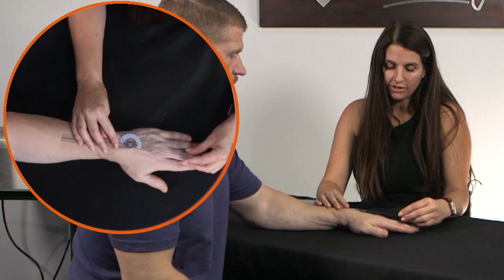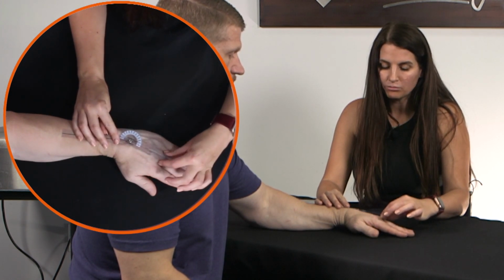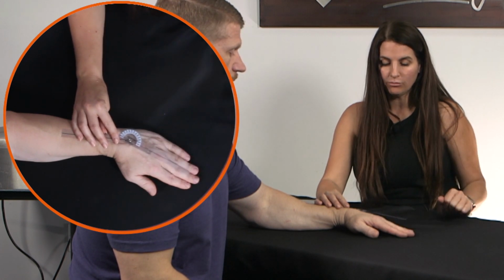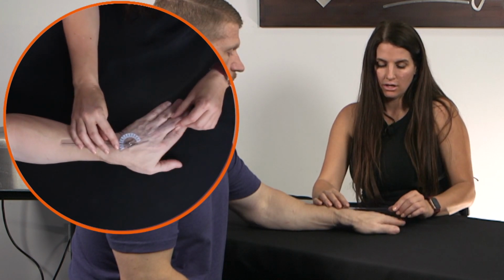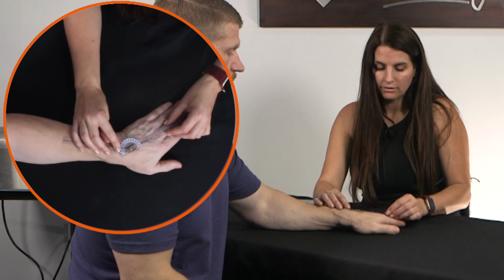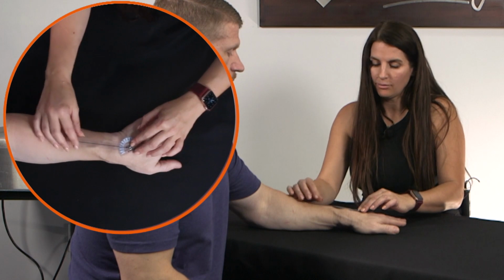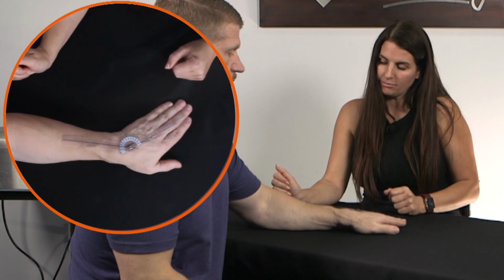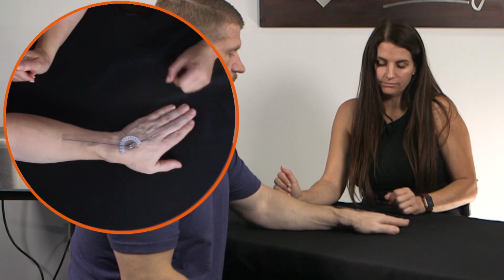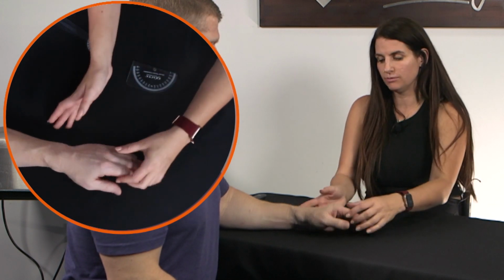Now go ahead and radially deviate. And then the radial deviation lines up, or the movement arm lines up, with the long finger metacarpal. And then the same, go up to ulnar deviation. And you want to make sure you still have your landmarks. So line it up with the long finger metacarpal, not the finger, the metacarpal, and then up the forearm. If you had a longer goniometer, that might be a little more ideal because you could see up at the more proximal point.